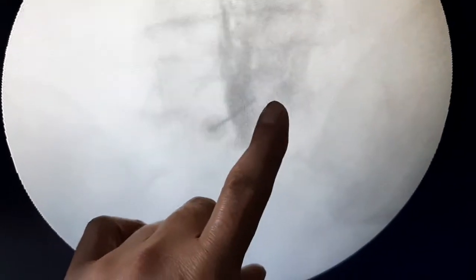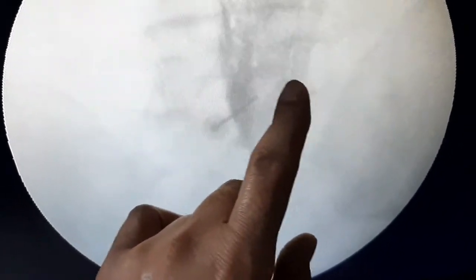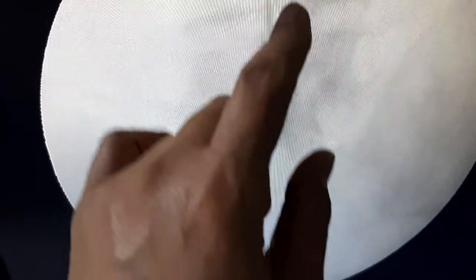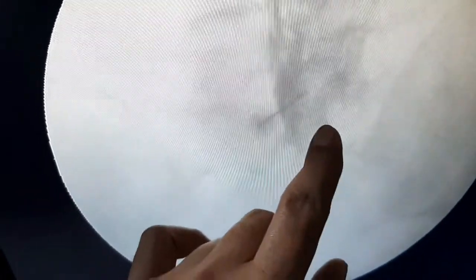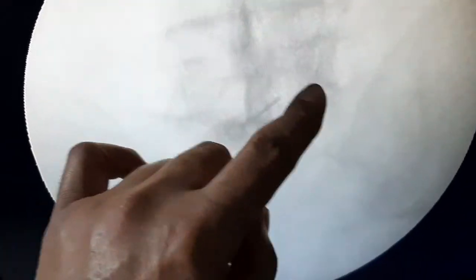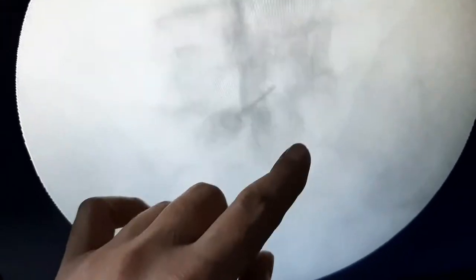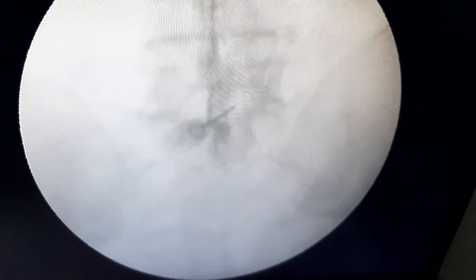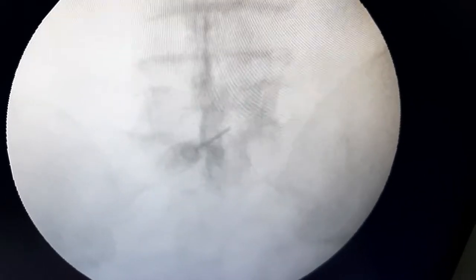In the AP view, you will see the dye is also going to the L4 root — L4, L5, and S1. This is my final picture. The dye is spread properly and these three roots are visible. This is a good pain relief outcome for the patient.